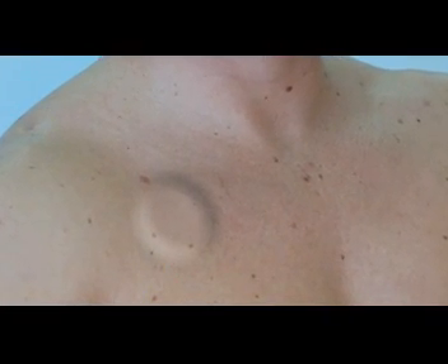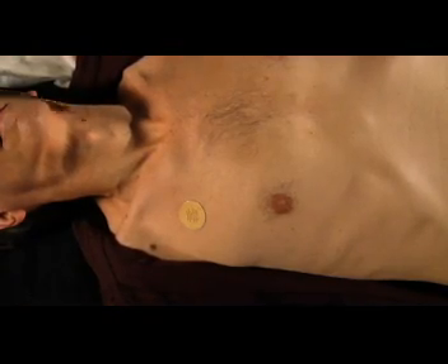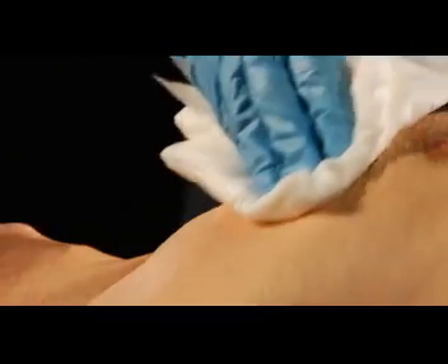Some patients have a surgically implanted device, such as a pacemaker or internal cardiac defibrillator. You will see a round or square raised lump under the skin of the chest or abdomen. It is safe to use the AED for these patients. If an implanted device is located where you want to place the pad, simply adjust pad placement one inch away from the implanted device and use the AED as normal. A patient may also have an adhesive medication patch. Using an AED over a medication patch can burn the patient's skin and decreases AED effectiveness. Use a gloved hand to remove any medication patch that may interfere with pad placement, then wipe the skin clean and dry before attaching the AED pads.